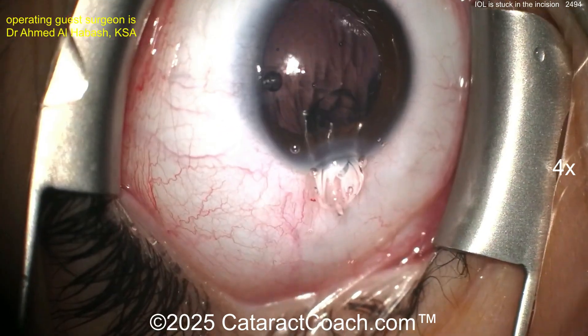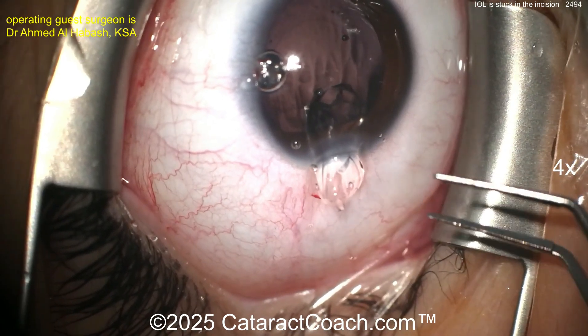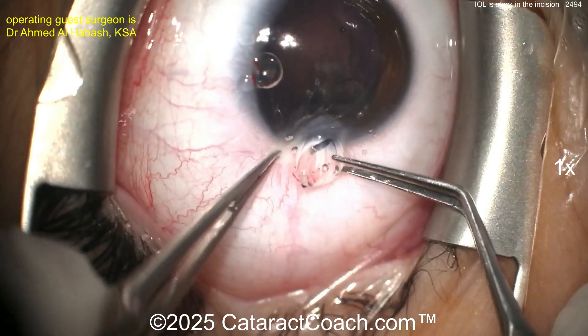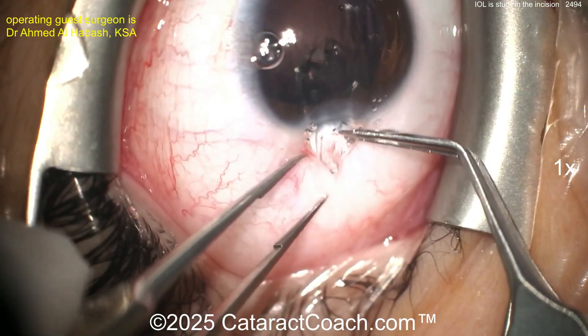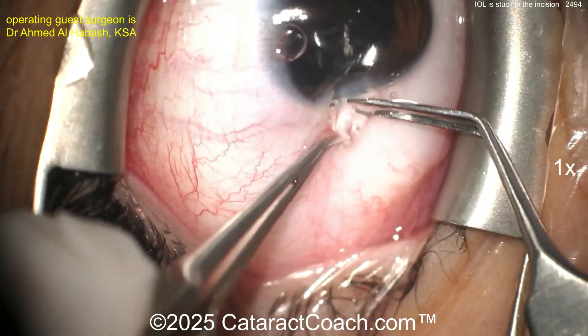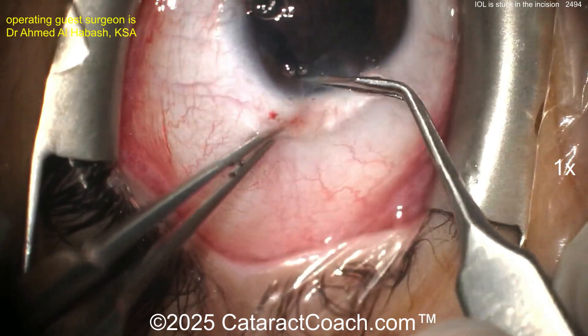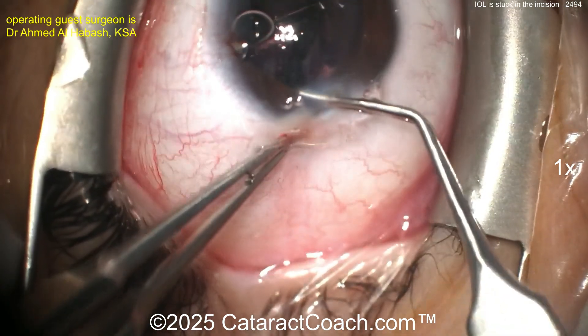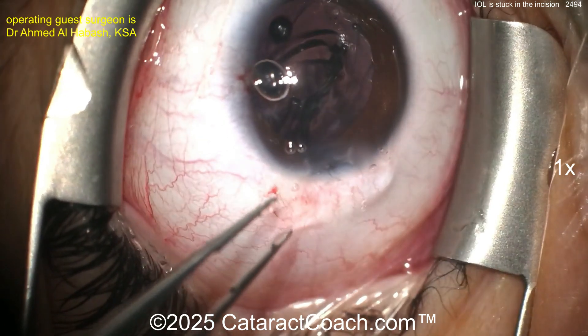With a hypotonus eye, another pair of forceps — I like that. Now you can inject more viscoelastic to get the IOP up, that's a good thought. It's not quite going in again. I'd want to enlarge the incision, because if you just push it in like this it can go through very rapidly — and just like that, now look: it's in the mid-vitreous, posterior capsule ripped right open.